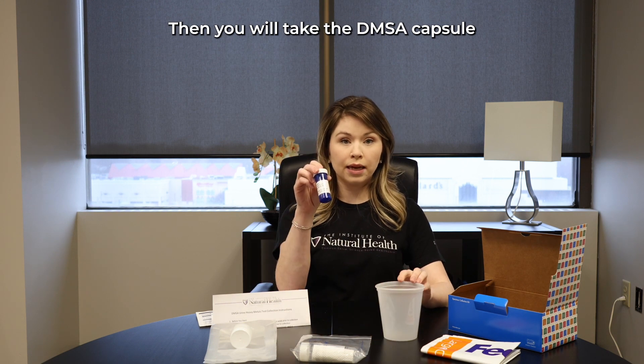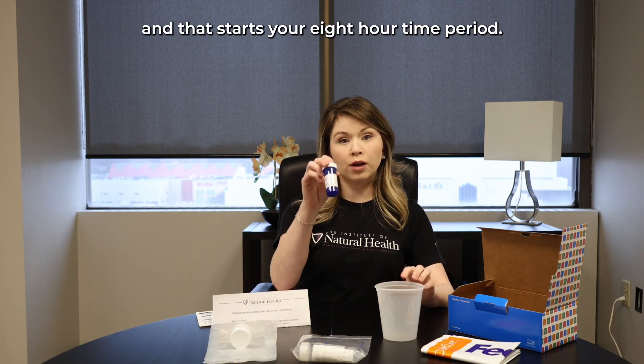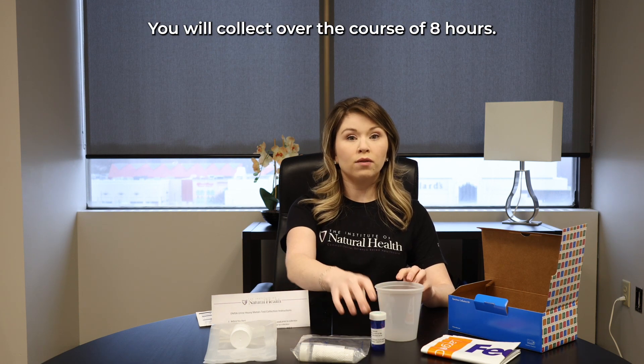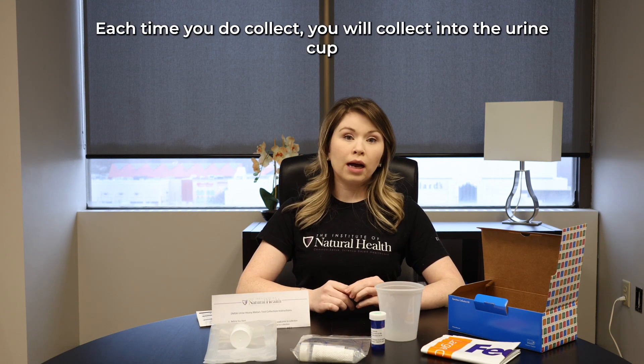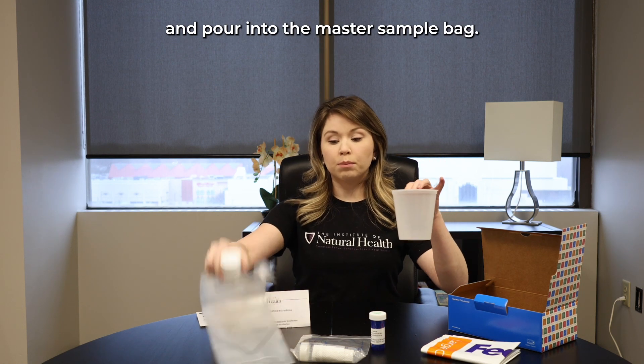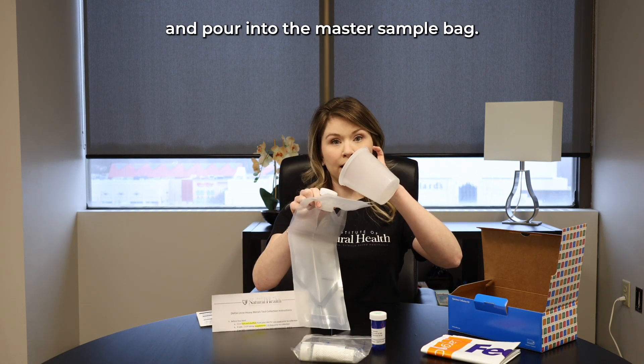Next, you will see step-by-step instructions on how to complete your collection. To start, you will wake up and void your bladder and get rid of the first urine of the day. Then, you will take the DMSA capsule and that starts your eight-hour time period.